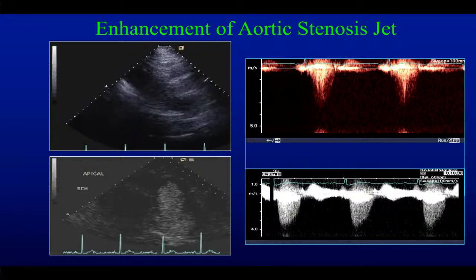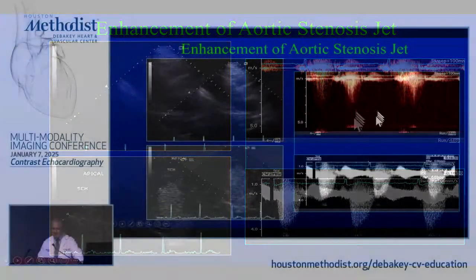Contrast in a patient with aortic stenosis, we usually don't use it as often, and we probably should not. If you have a good jet, you should not use it because you will enhance it and you'll increase the velocity. And if you want to push your luck to have more TAVR or SAVR, it's not a good thing, ladies and gentlemen. I know we tried in the past, should not.